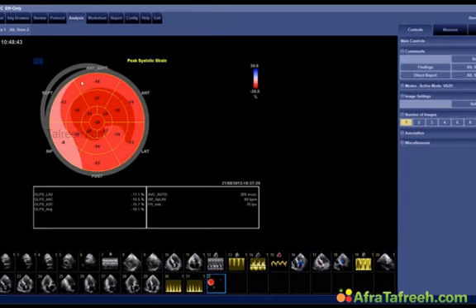And what do you see here? Well, you see that truly longitudinal function is starting to deteriorate here in the basal septum and the basal myocardial segments, and it's still okay here in the apical segments. So what usually happens in aortic stenosis, you will have a gradual decrease from basal to apex with respect to longitudinal function.